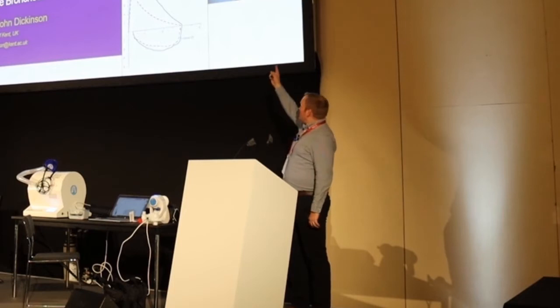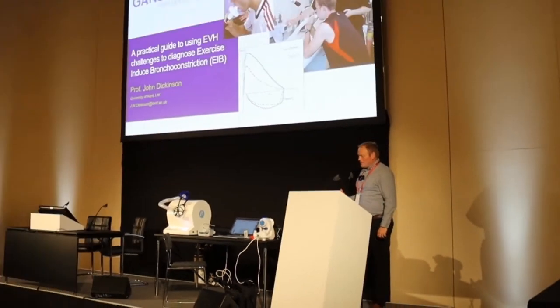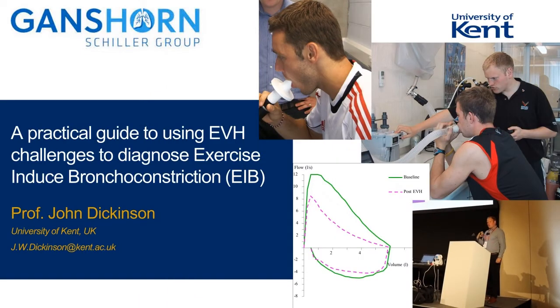So I've been using Eucapnic voluntary hyperpnea for around 20 years with athletes in the UK. To evidence that, I've got a nice picture of me when I was young and looking much better than I do now. I've used it with a number of athletes, whether they be Olympic athletes, professional athletes, but also recreational athletes, children and more elderly people. So it is a test specifically trying to diagnose exercise-induced bronchoconstriction, but it's not exclusive to elite athletes.